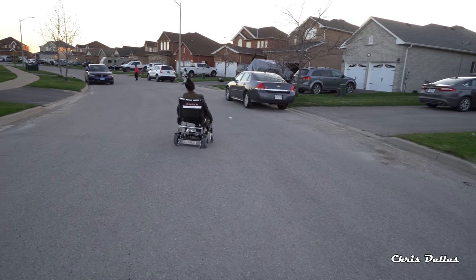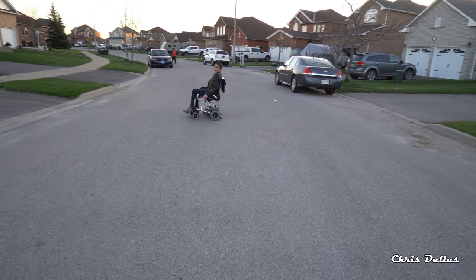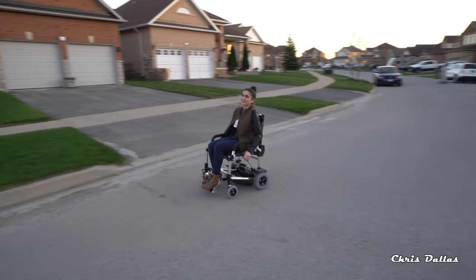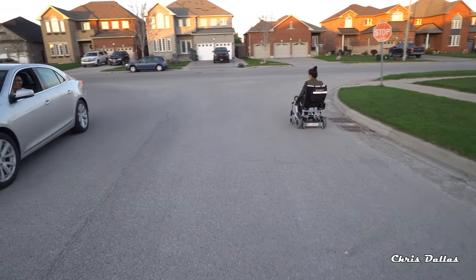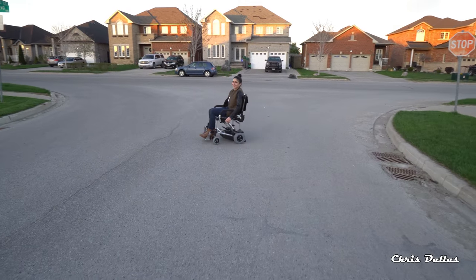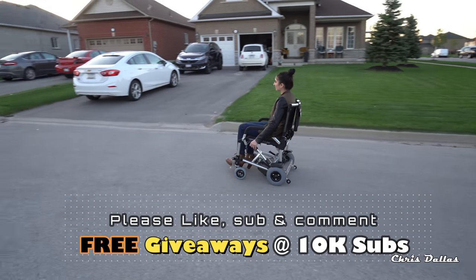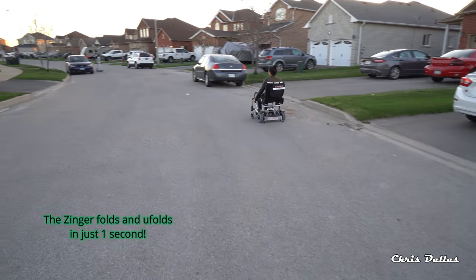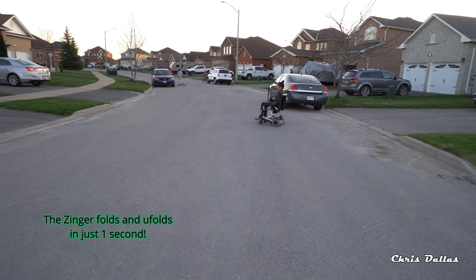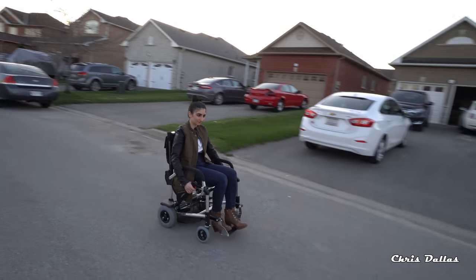It doesn't look like a wheelchair. You don't have to worry about being seen in a wheelchair — anybody could be doing this. If you're injured and can't walk and you want to go somewhere, the chair weighs about 38 pounds. It folds in about one second — it folds and unfolds in just one second. We're going to show you soon.